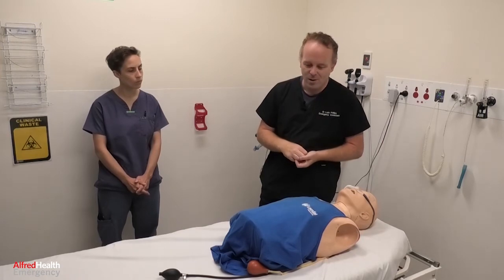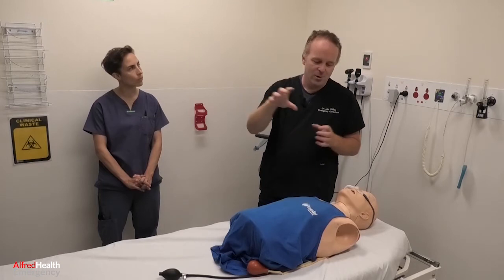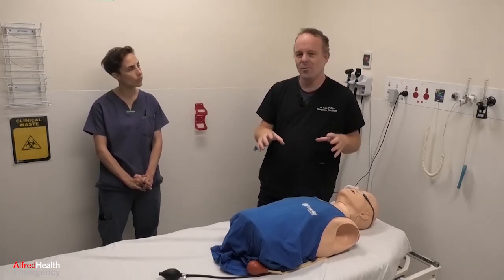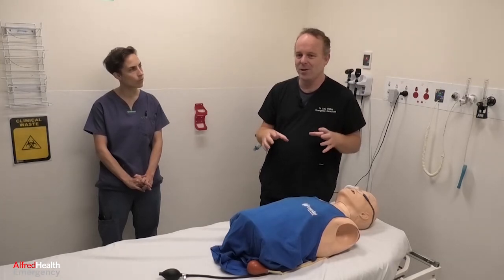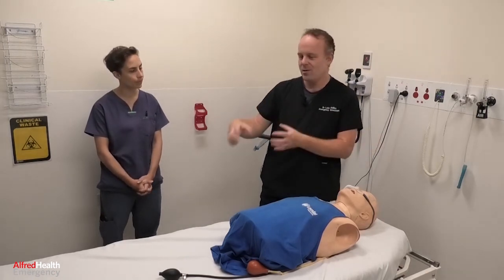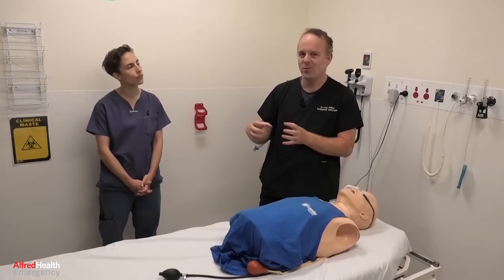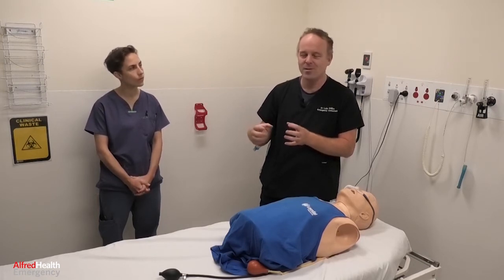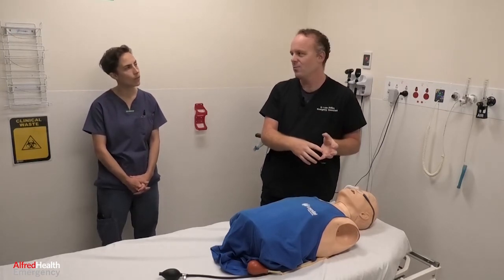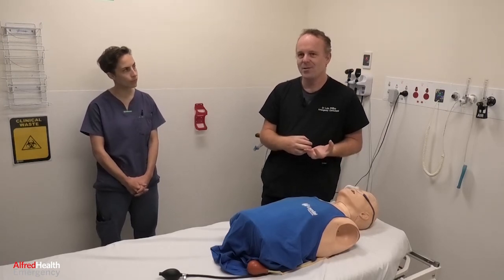In terms of the intubation side of things, we're setting up all our equipment outside the room. When we come into the room, the people you want in the room are the people necessary to perform the intubation. Everyone else can wait outside. We want the airway doctor, the team leader who is also airway competent, and when we say airway competent, we're talking more than 100 intubations of experience. And we want an airway nurse to come into the room as well. That airway nurse may already be in the room caring for the patient.